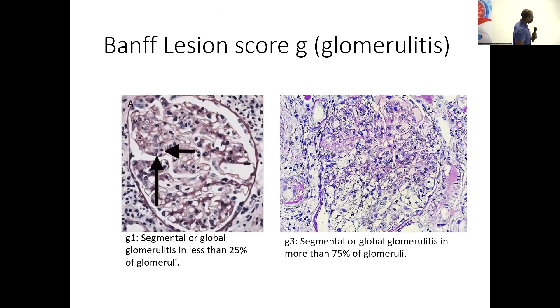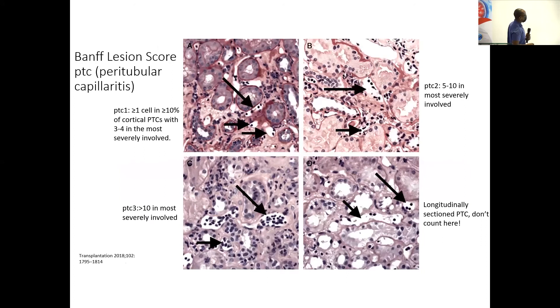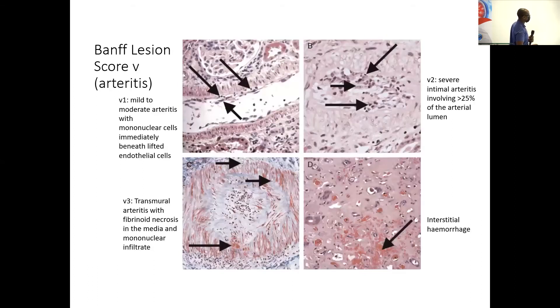These photomicrographs show what we mean by glomerulitis — the presence of inflammatory cells within the glomeruli, quantified based on the extent within the biopsy. The images also show peritubular capillitis: the capillaries present between the tubules, where you count the number of cells to determine the score — one, two, or three — depending on the number of involved vessels.